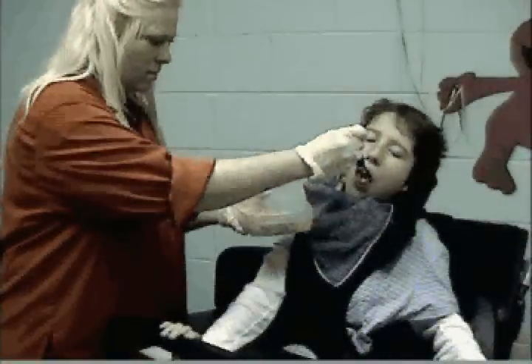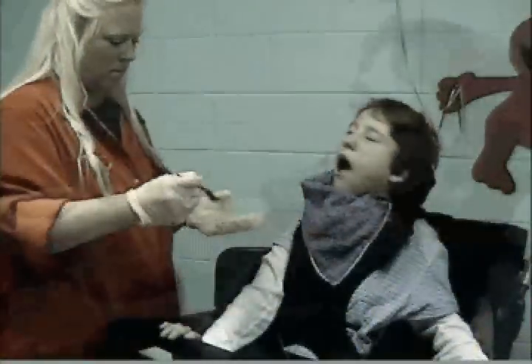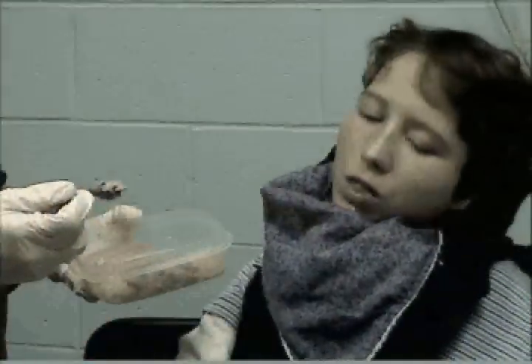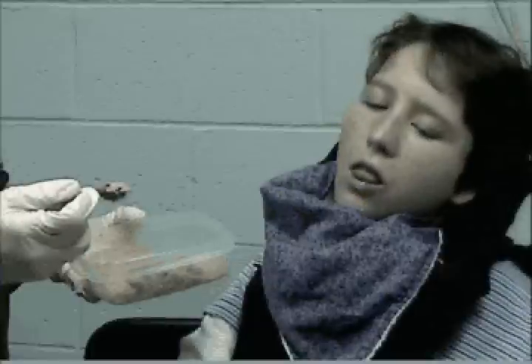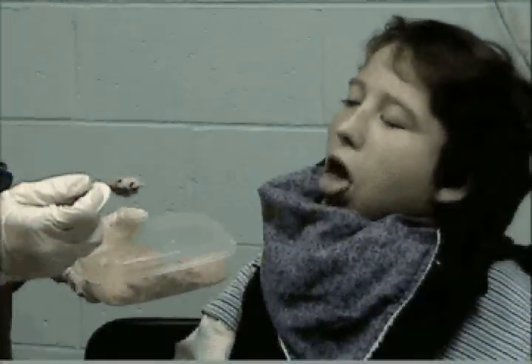We find that when the head is in a more midline position, it does help with the swallow because the anatomical alignment is a bit better. Also, for lip closure and being able to manage secretions, it's better when the head is upright. When the head is down, things tend to pool out, and it's harder to get a swallow in a head-down position.